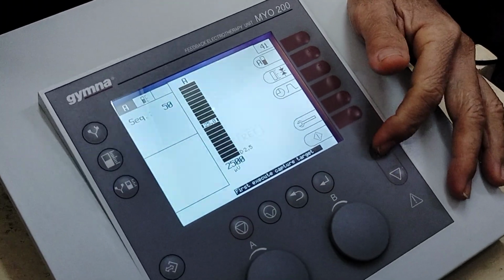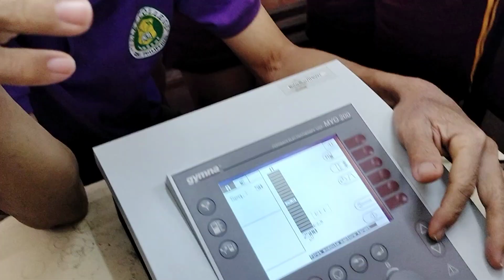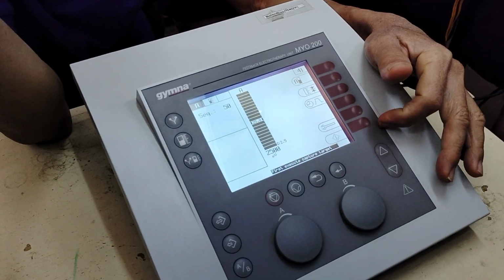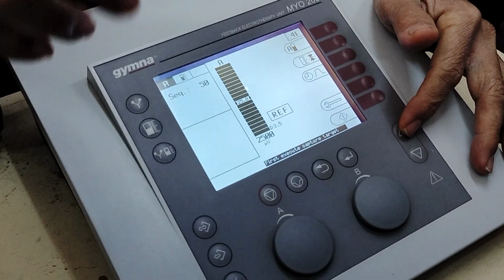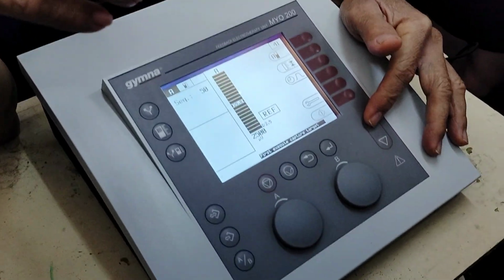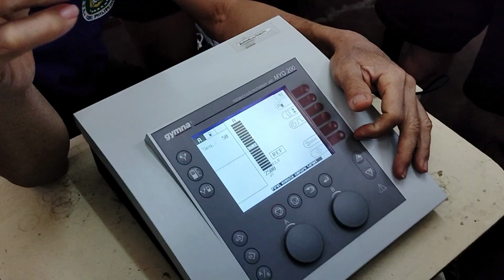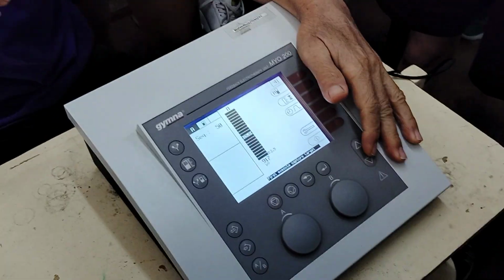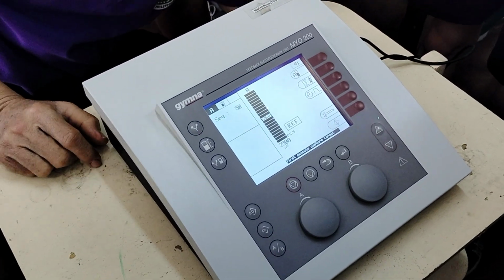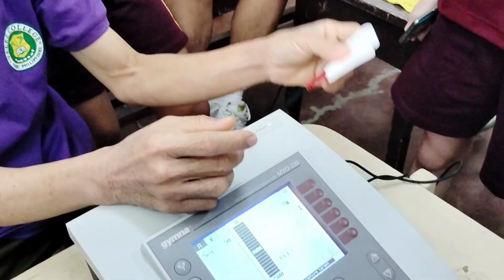Cases like bowel incontinence, wherein the patient cannot control the anal sphincter, and you want to do some exercises and at the same time do biofeedback, so you can use this pressure. But the electrode for pressure is different. It's not the electrode for EMG, which is used for motor unit action potential.